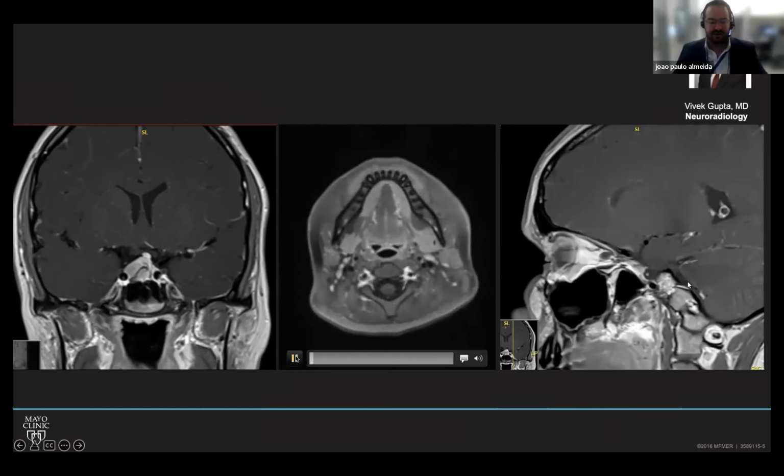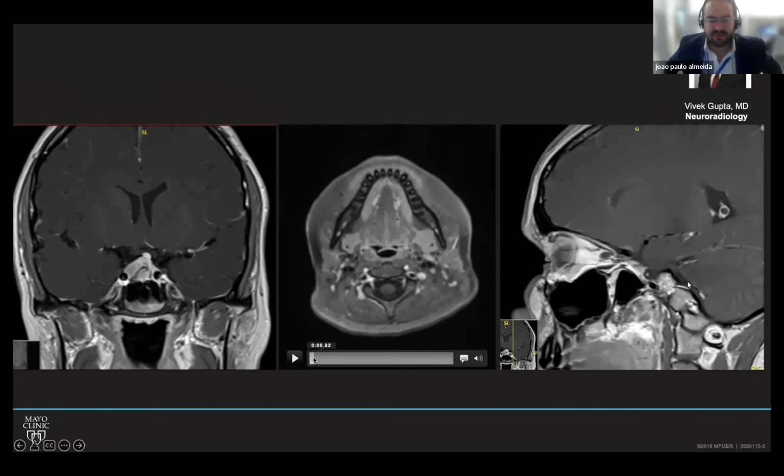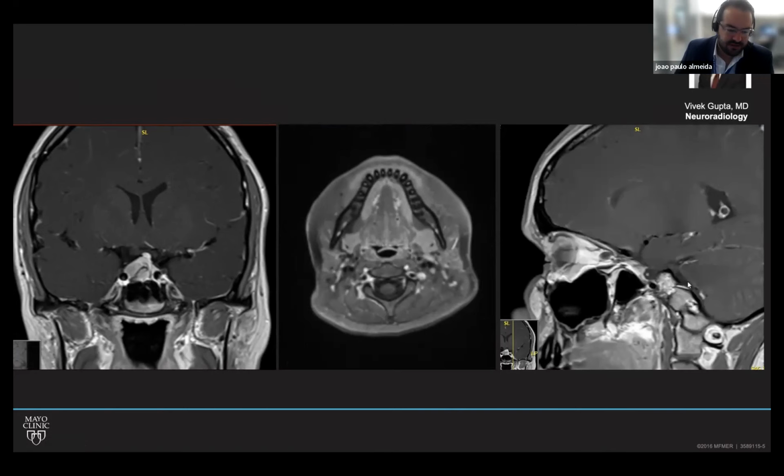I'm gonna stop you there for a moment, Luisa, just to show a few points here, because I believe that's important and should be mentioned. You see this area here? This is the optic chiasm. And then what you see right here, this is the pituitary stalk with the pituitary gland. So this is the stalk here, and this is the gland. Therefore, the stalk is not really compressed here, but the tumor is indeed going towards the chiasm, but there is no real encasement here. And then the tumor is this area that you see right here.